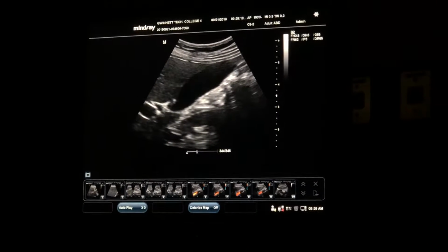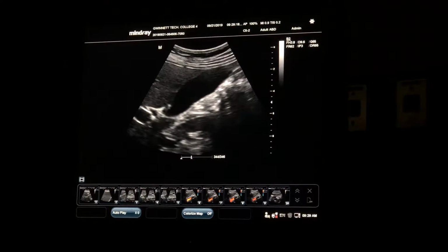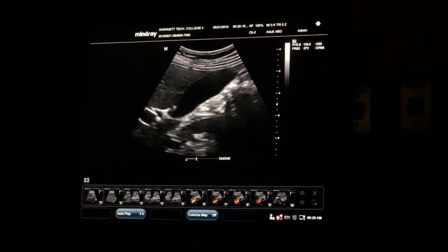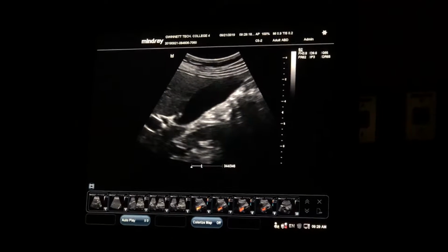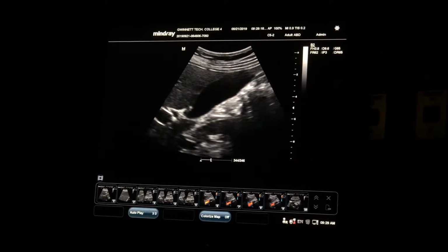These little polyps are weird. Sometimes you're down here at the kidney, you did a whole gallbladder evaluation. I've done this when I was a student. I did a whole gallbladder evaluation, everything looked good. I'm down here looking at the kidney, I angle up and I can see a polyp in the gallbladder. Well, what the heck, I couldn't see it then, probably because I only used one window and I didn't really understand exactly how to evaluate it fully yet.